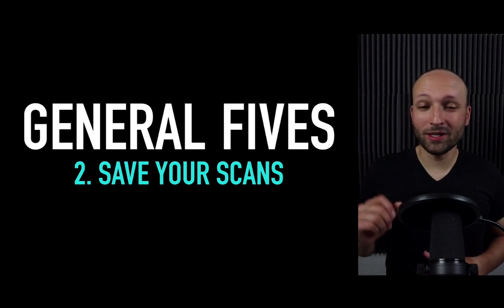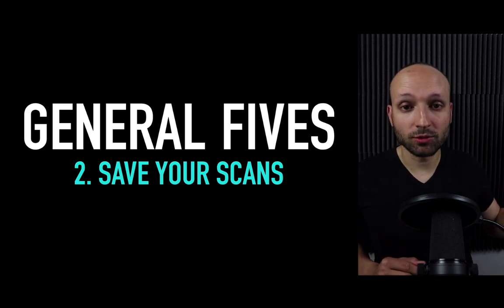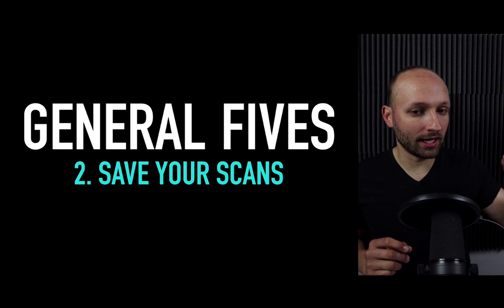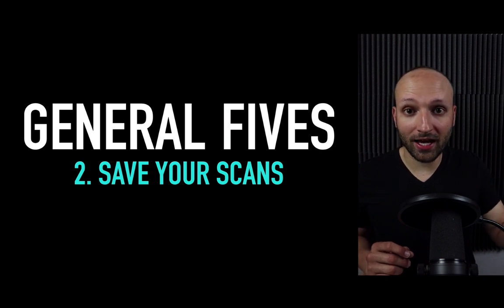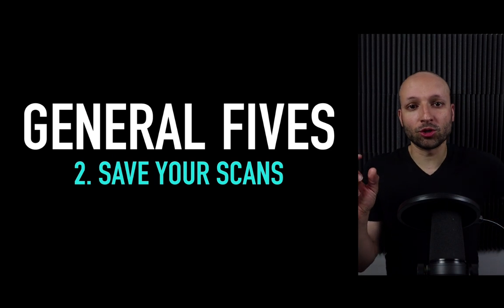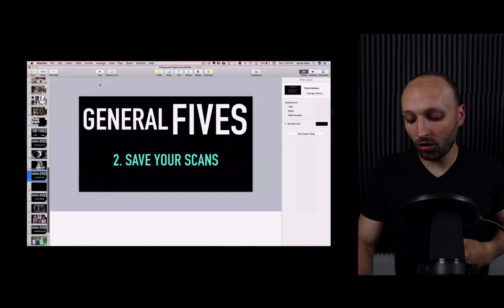Tip number 2, save your scans. What I do is I have a thumb drive that I keep at work. It never leaves work. And then I have an encrypted hard drive. I will save my scans to that unencrypted USB drive that doesn't leave work. I then will put that into a computer and attach my encrypted drive into that computer and transfer the stuff into my encrypted hard drive, and that's where I save all of my scans. And I actually have them all organized.